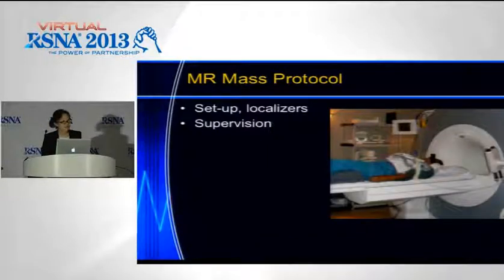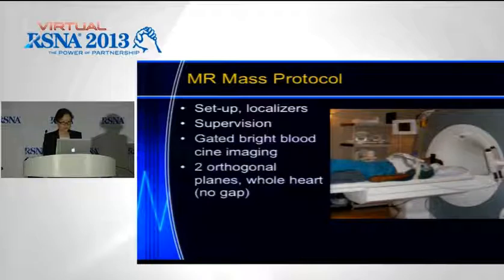Moving to MR, so beyond our general setup and localizers, I would advocate supervision by either a radiologist or a cardiologist. Often with mass imaging, we're going off the standard planes, and it's just helpful to have somebody who has some knowledge of masses to tailor the examination. So there's many ways of performing a mass protocol.